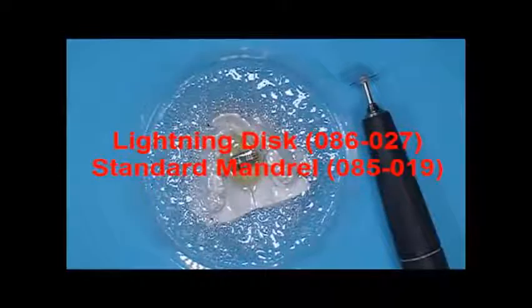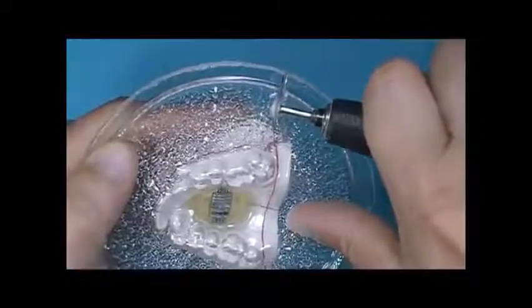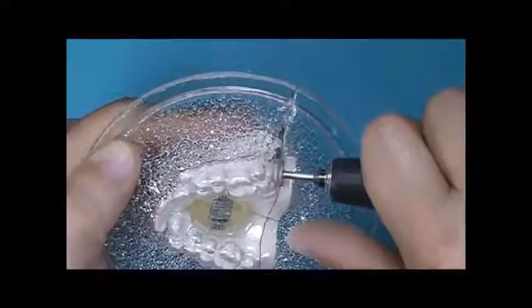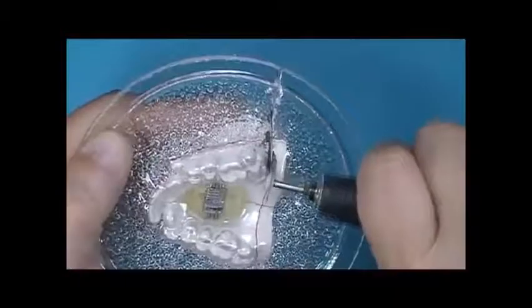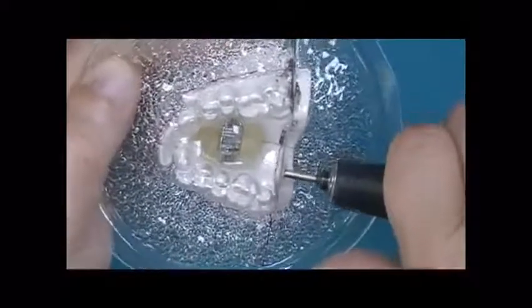Prior to formed plastic removal from model, a rough outline of appliance is cut out using a 3/4 inch lightning disc with a lab handpiece. Starting at the outer edge of disc, cut plastic approximately 1 to 2 millimeters behind the last posterior tooth on each side of the arch. Then remove back plastic.